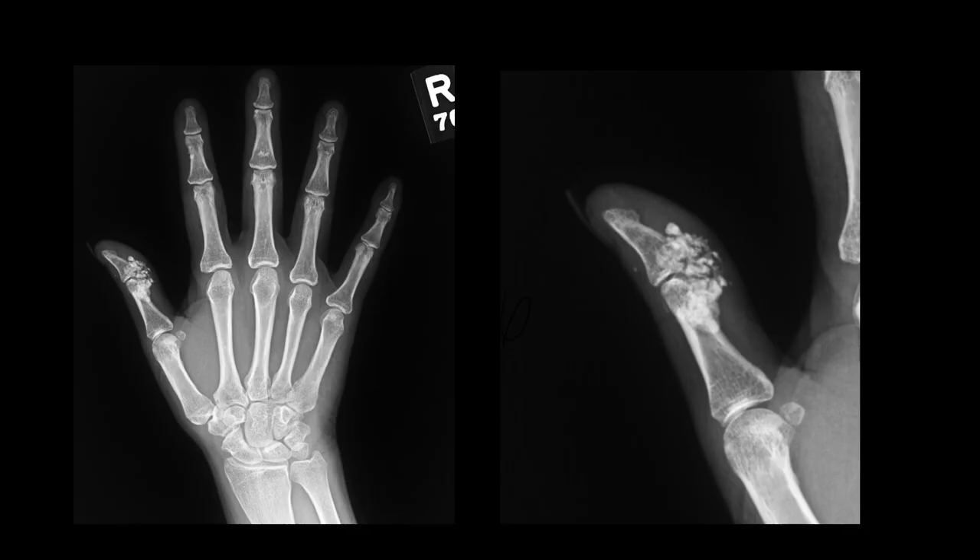On this initial radiograph of the right hand, PA view and magnified view of the thumb, the most marked finding is this clump of calcification about the interphalangeal joint of the thumb. On the blow-up view it is cloud-like — there is no matrix production within that increased density, so it is definitely a calcification. There are other small calcifications in the soft tissues of the hand. We don't see erosions at the metacarpophalangeal or interphalangeal joints, and there may be a little bit of resorption of the distal phalangeal tuft of the index finger, but that is not too marked.